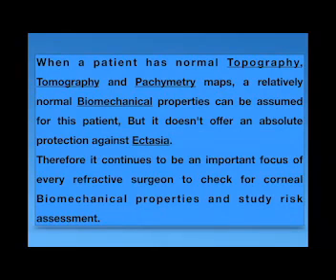So again, after 10 years of fading out of the corneal biomechanics, we are coming back now to put it in focus again. Last week, I met Professor Ambrosio 3 times. And every time he repeats that the corneal biomechanical properties are included in the new modules for studying the risk assessment and the patient's susceptibility to ectasia.